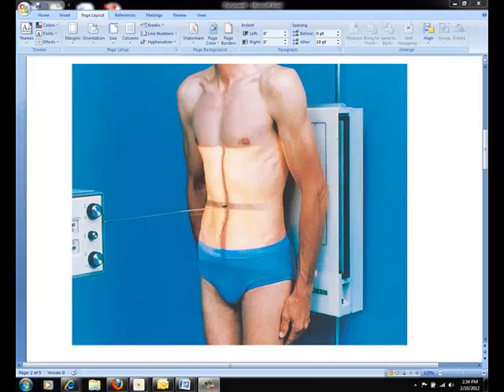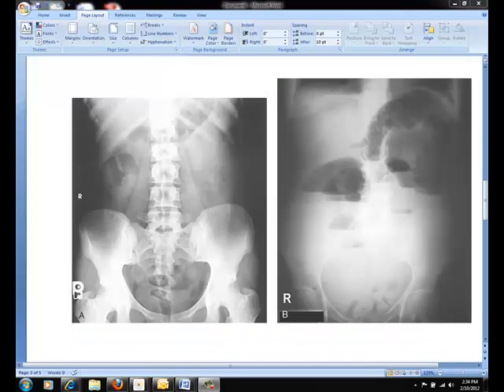For both radiographs, suspend respiration at the end of expiration in order to make sure that the abdominal organs are not compressed. When evaluating the supine abdomen, the area from the pubic symphysis to the upper abdomen must be visualized. This is seen in the radiograph on your left. Also notice that the soft tissue gray tones in the psoas muscles, the lower border of the liver, and the kidneys are well visualized.